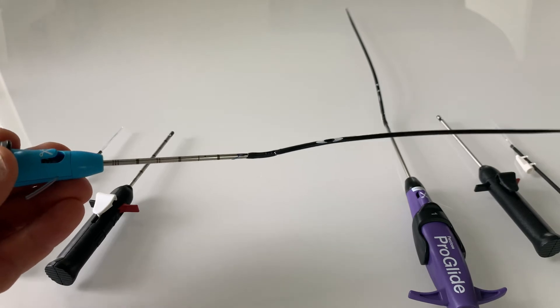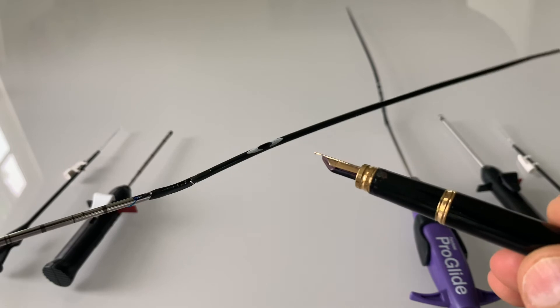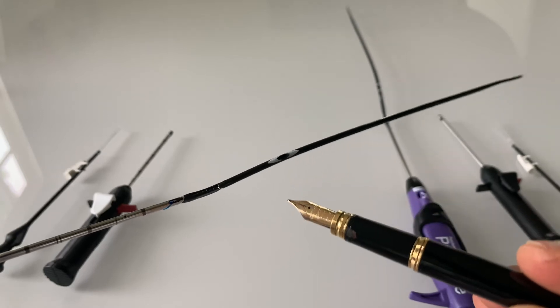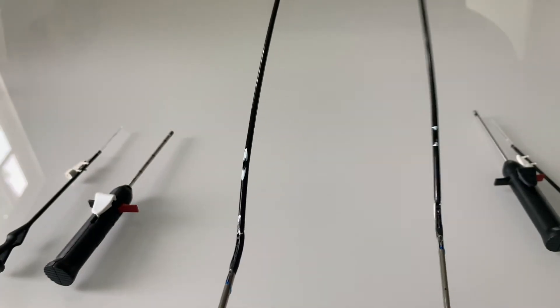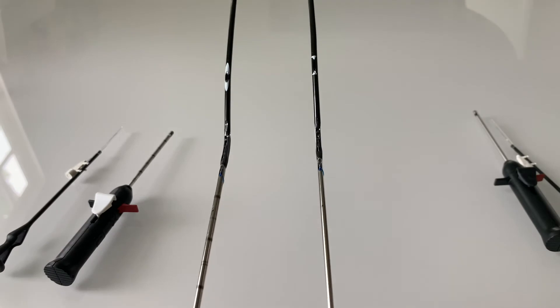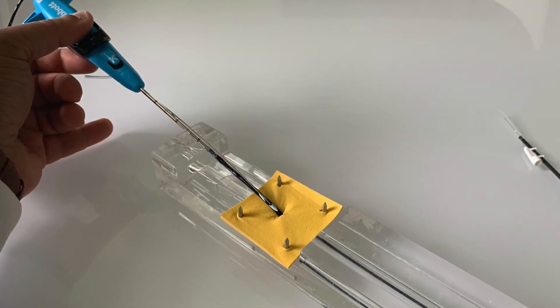The wire insertion port is now slightly larger and marked more clearly. Here it is compared to the original design, and here it is again in our model for closure.